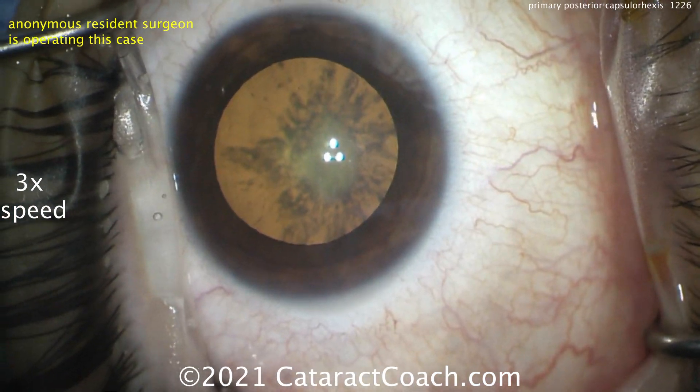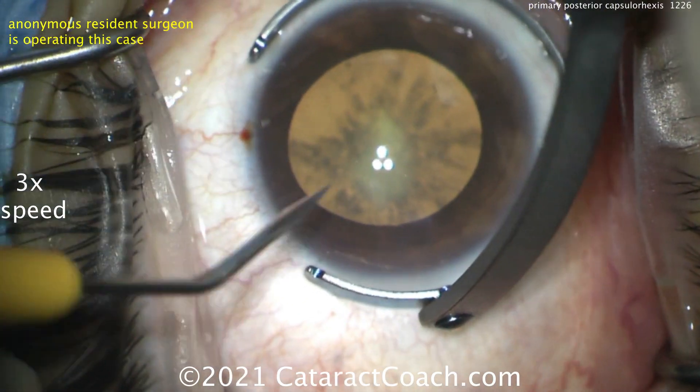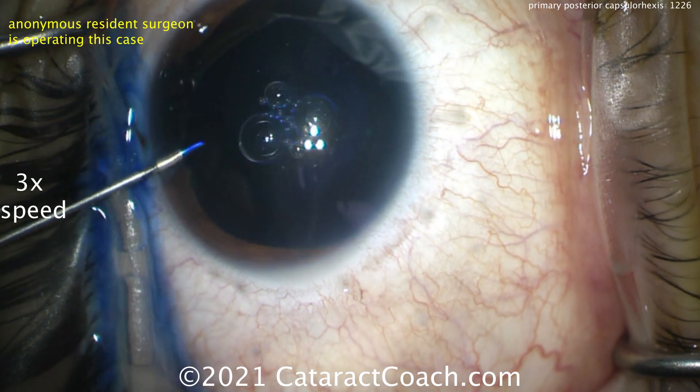Adjusting the speculum — get everything set up the way you want it. We have a young resident who's operating this case, and we're going to give this resident some help when it's time to do that posterior capsular rexis. In a young patient like this, the nucleus is very soft.